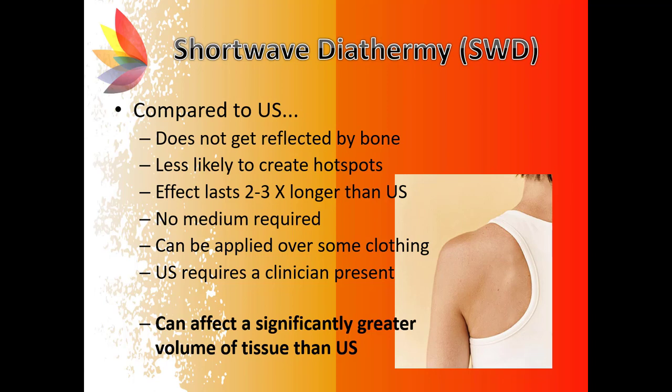There is no medium required with shortwave diathermy. Shortwave diathermy can be applied over some clothing. Shortwave diathermy, once set up by the clinician, can be administered to the patient without the clinician's presence. Ultrasound requires that a clinician be present for the entire length of the treatment.